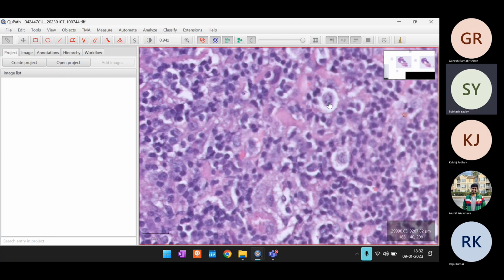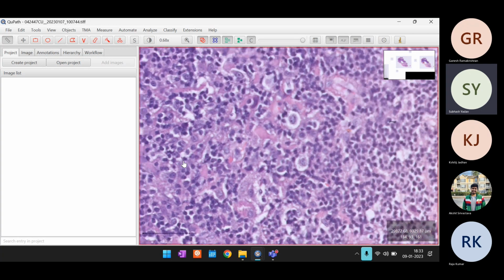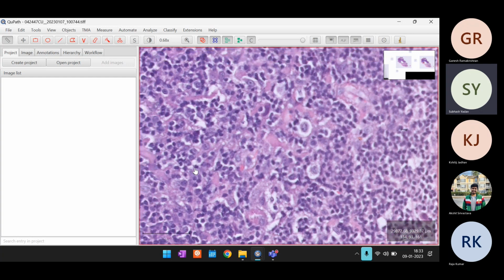Come extremely left, around 9 o'clock, and a little down, the large cell. This is also an RS cell, the one on the right, a little right. Anyways, the one I'm trying to say is that the large ones are easily identifiable, and the one which had clearing around, inside that you can also make out a small dot.